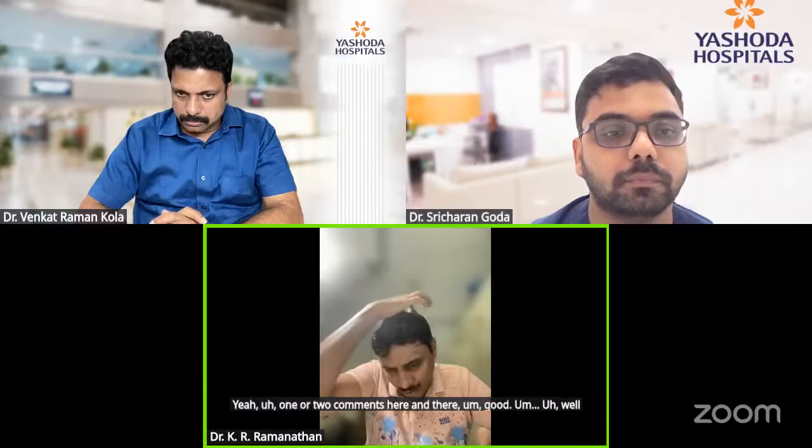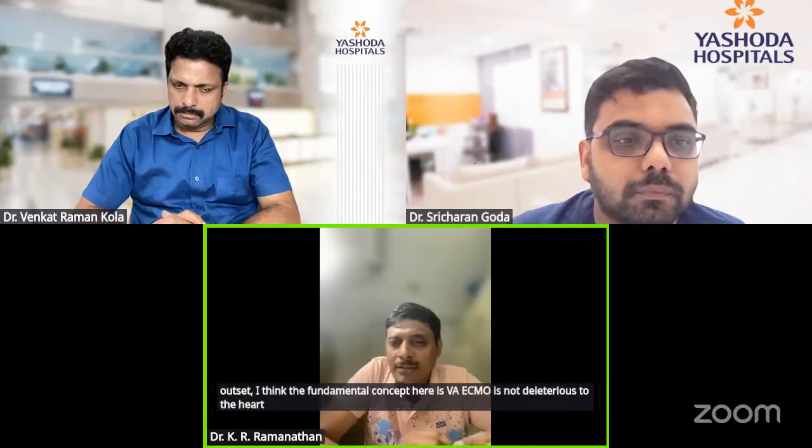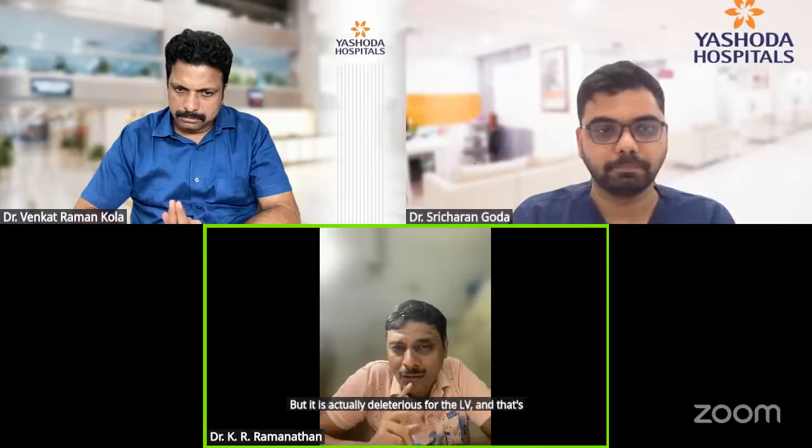Well, at the outset, I think the fundamental concept here is VA ECMO is not deleterious to the heart all the time. If you look at the configuration, it's RV protective, but it loads the LV. So clearly, that is where most of the problems come when the LV tends to recover. If you consider the heart as a whole, it's in fact very friendly to the RV, but it is actually deleterious for the LV, and that's where this talk on LV unloading becomes very important.